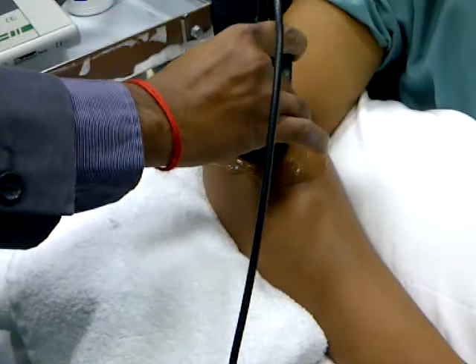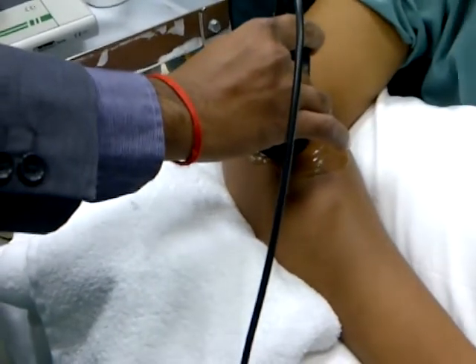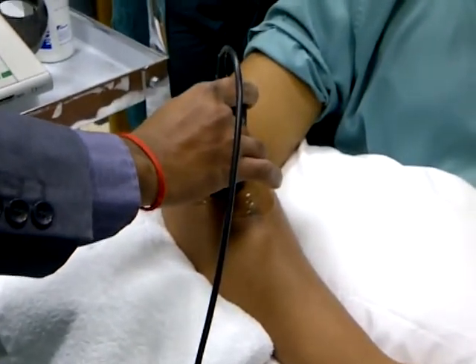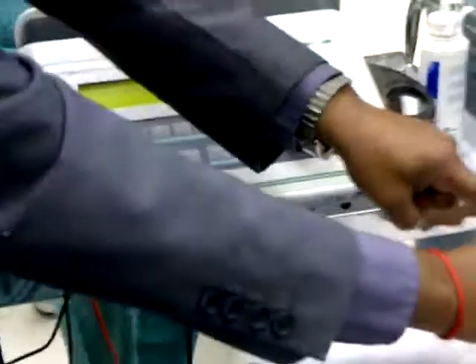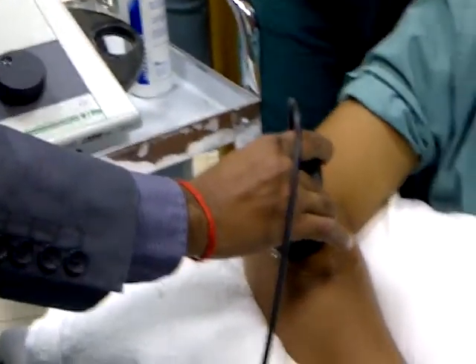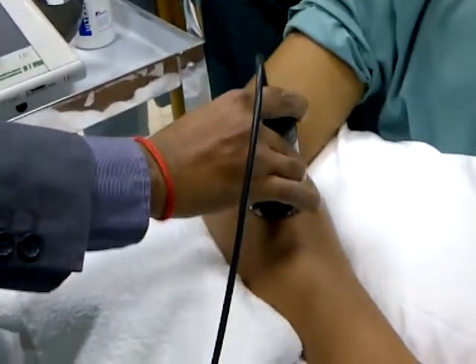Firm contact, that is pressure, and circle. What is the give? If I give more intensity, he will feel heat if I am not moving. If I increase the intensity and I am not moving the head, he will feel more pain or discomfort down in the bone. Why? Because of periosteal burn, or you call it a cavitation problem. Deep bone.